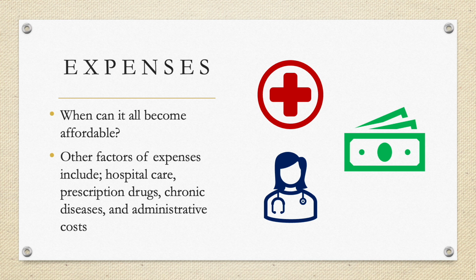One of the concerns in all of this technology is the affordability for the use of it. For example, the robotic surgery I mentioned earlier has a product called the Da Vinci Surgical System, which was first discovered in Europe in 1999, but was not permitted in the US until the 2000s. Each time this product is used in surgery, millions of dollars are being spent.